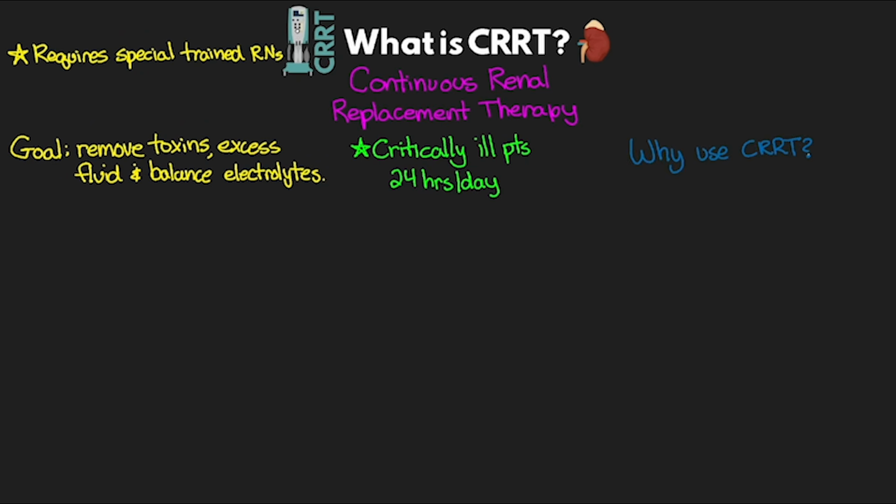And so I really hit on some of this already, but we're going to use CRRT in the critically ill, unstable patient who have AKI, or acute kidney injury, and are in acute kidney failure, or in patients who are end-stage renal patients who receive dialysis who are also too unstable to receive normal IHD.